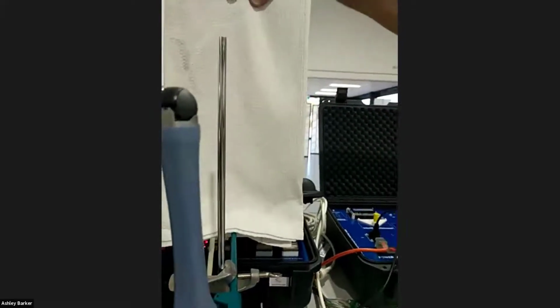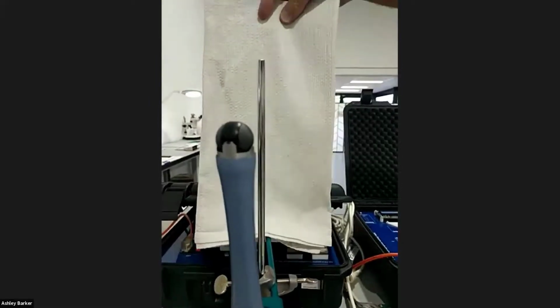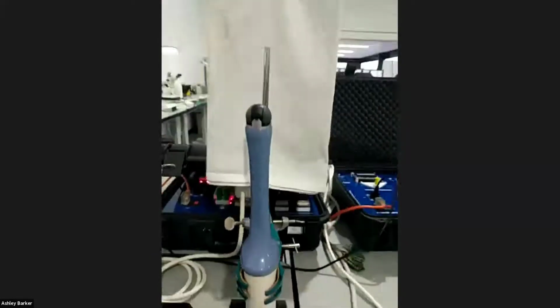Sorry, excuse my cough. That's why it's really important not to drop 3D probes, because they are mechanical and they're delicate. Any probe really, but particularly 3Ds. I'm always heart in my mouth; it's a trained thing, anytime I drop a probe on the transducer end. But I'm looking at the insides of the cable connector and thinking, I've never been as worried if I drop the cable end. Is it as risky to drop the cable end as the transducer end? I would say don't drop either is the best option.